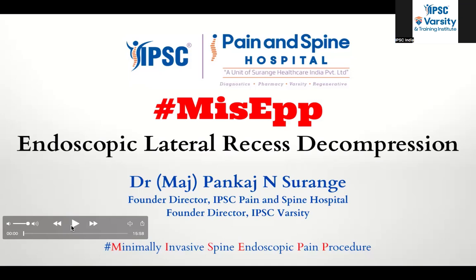When we see the MRIs, axial sections and sagittal sections, at times we hardly see any compression over the nerves. But if you look closely at the sections taken through the lateral recess in the axial sections, you may find the traversing root getting compressed there. Most of the time, when radiologists measure the axial diameter of the spinal canal, they take it from the center, and it looks like a good, huge canal.